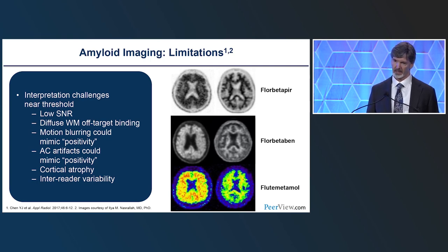So if you look in these scans here, for example, right here, you always want to see this thin line out here, right? Don't accept it if it's... raise some caution if there's two or if it's blurred. All right. Also look for asymmetric tracer, one side being brighter than the other.